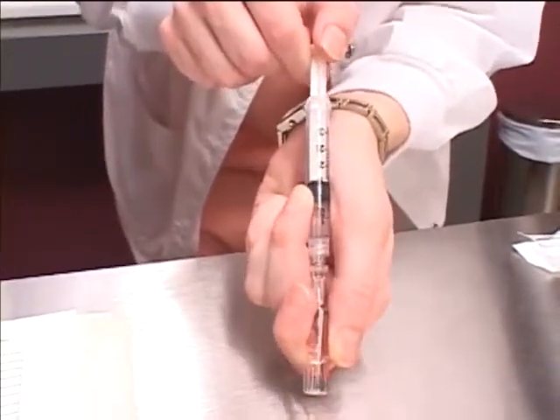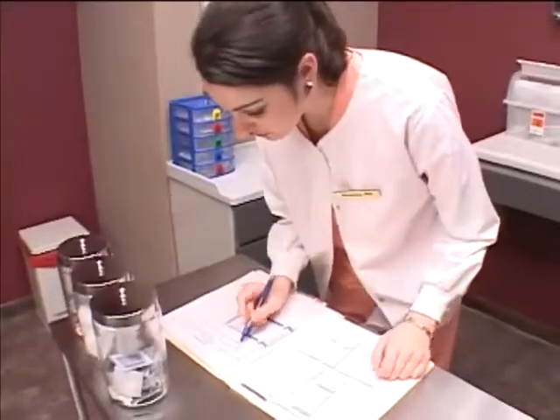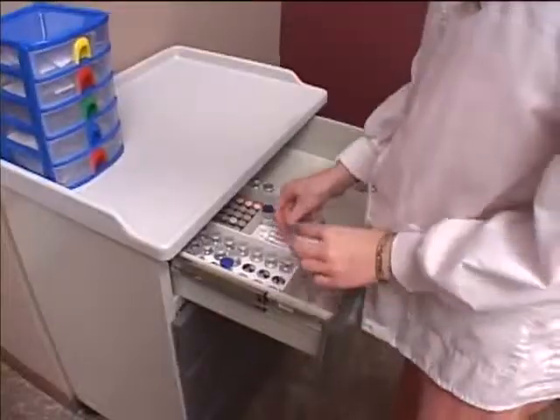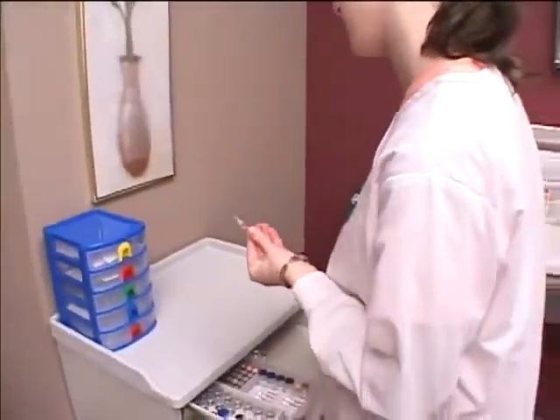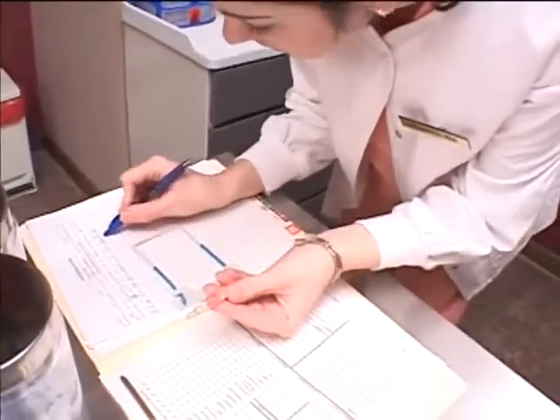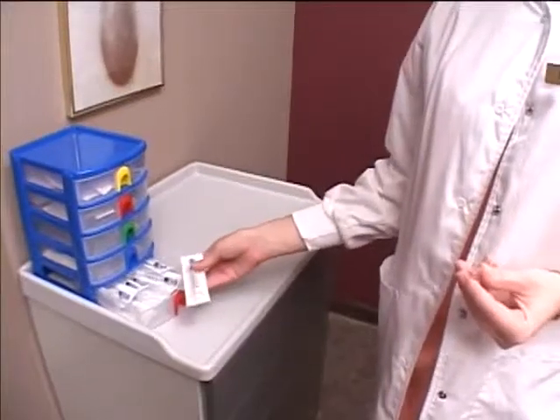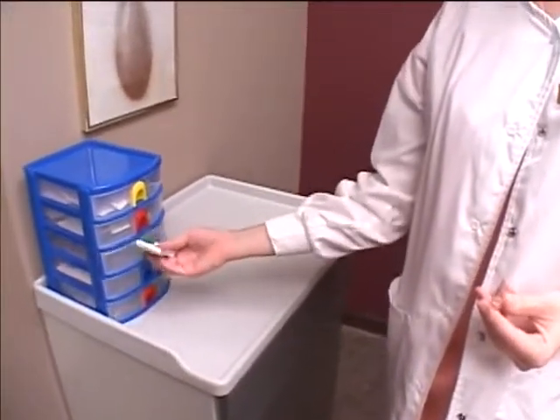When ordered to withdraw medication from an ampule for administration, you should begin by washing your hands. Check the physician's order. Select the appropriate ampule and prevent error by verifying it against the physician's order for the 6 rights. Determine the route the medication will be delivered to ascertain what size syringe and needle will be needed.